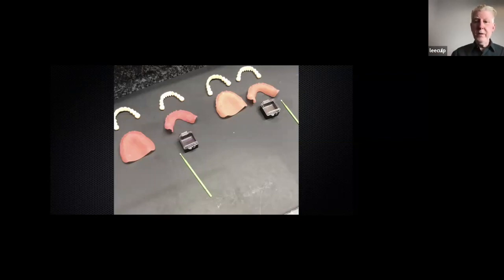So if it's milled PMMA to milled PMMA, then we would paint on Connect on both sides. If it's printed teeth to printed base, we don't need to do that. We still need to sandblast and then clean them up.